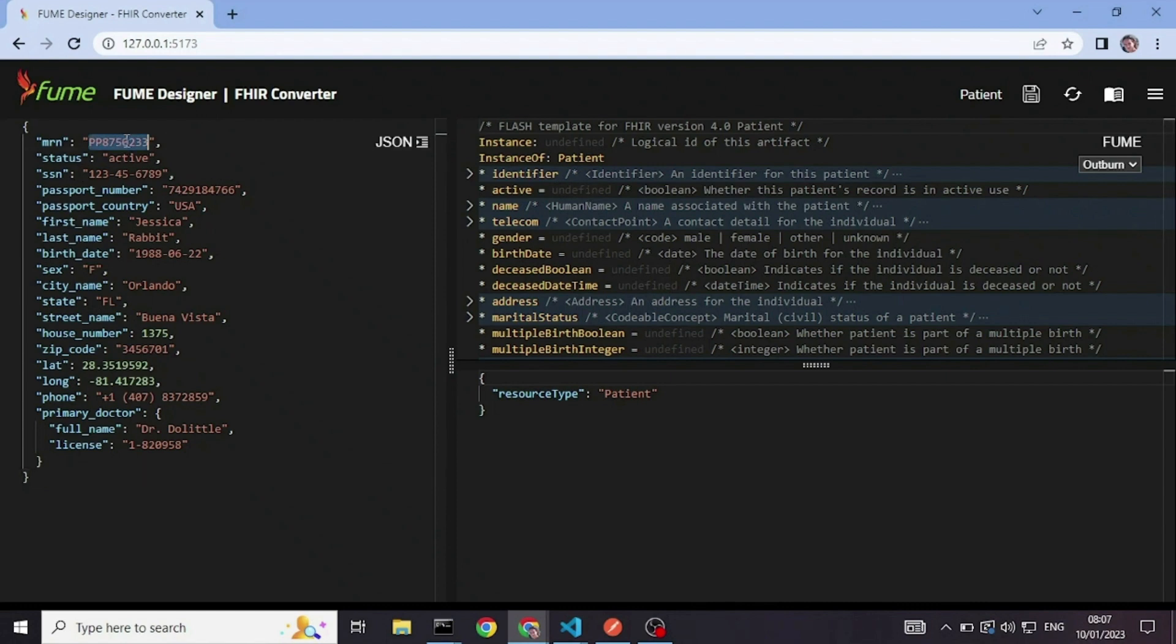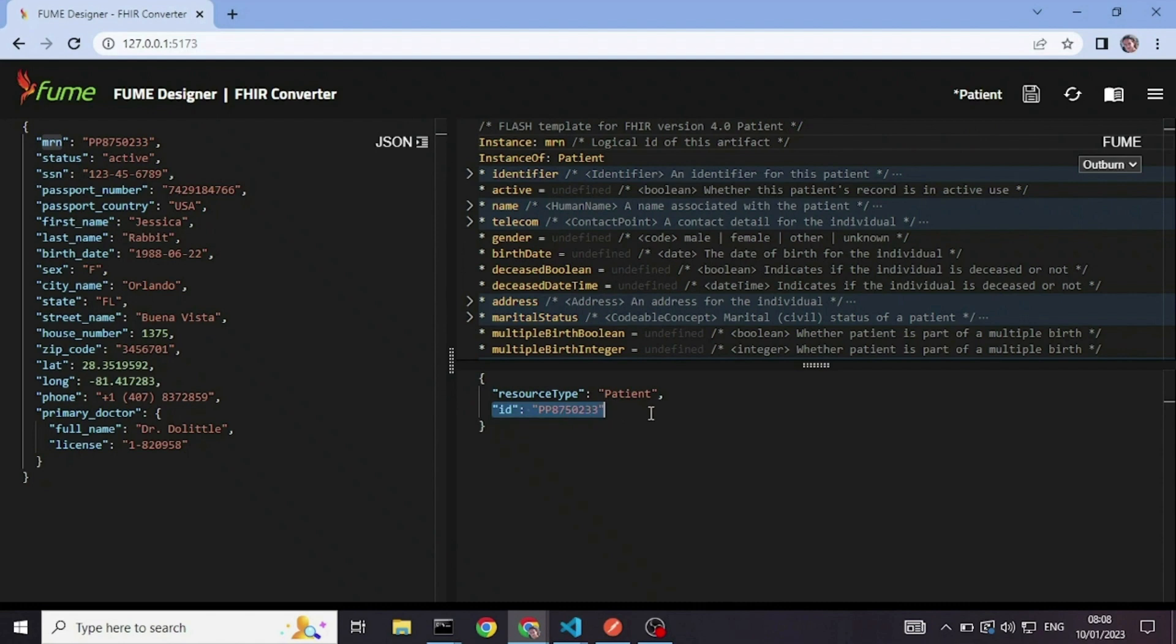So for example, I will take the MRN field name and put it as the instance ID. This will become the logical ID for the resource.